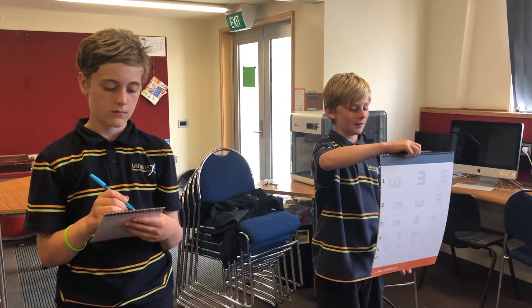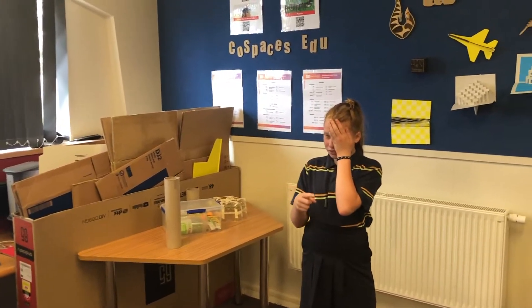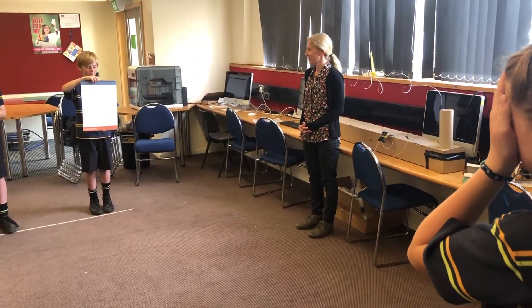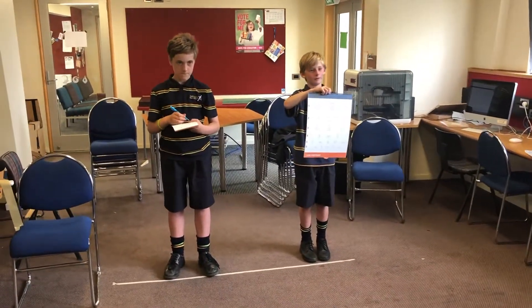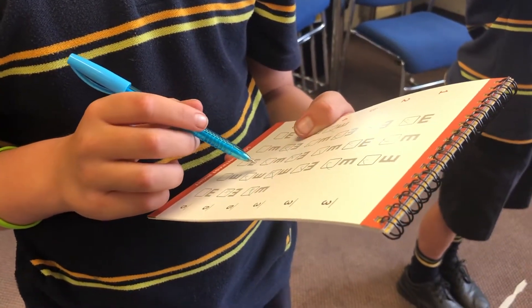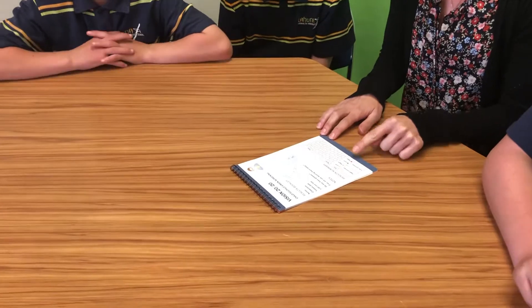Now please cover your left eye and begin reading the chart. This results summary chart is going to give us your final score for each of the four tests.